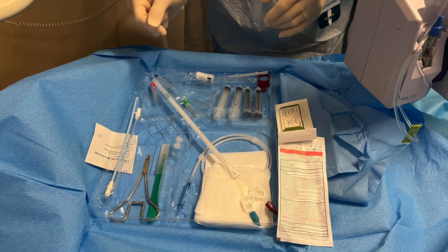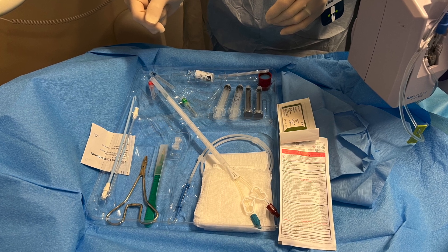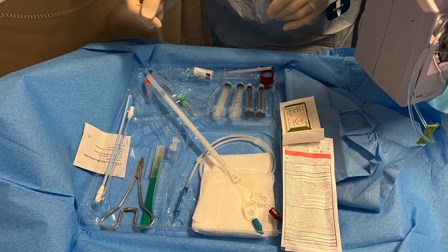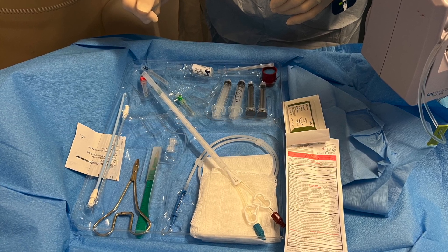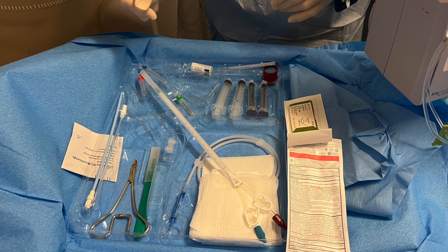The first thing you need is a dialysis catheter, and most of these will come in a kit. The kit will have the catheter as well as all the equipment to place it — the guide wire, a dilator, and those types of things. Some of these will have two ports and some will have three. A dialysis catheter normally just has two. A trialysis catheter will have two ports for the dialysis and then a third port that you can use for IV fluids if you need them.